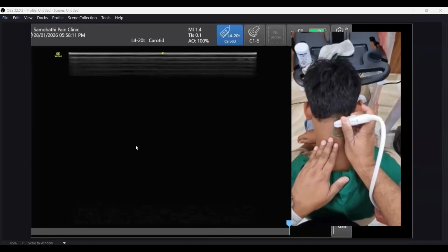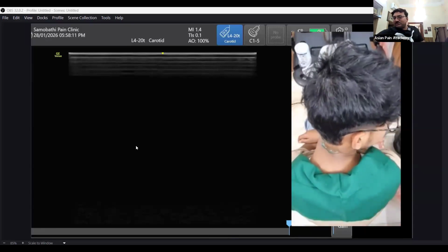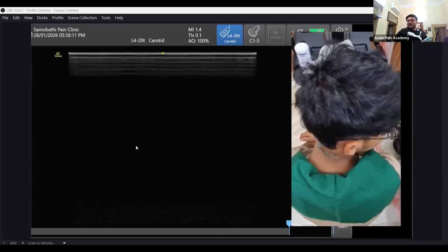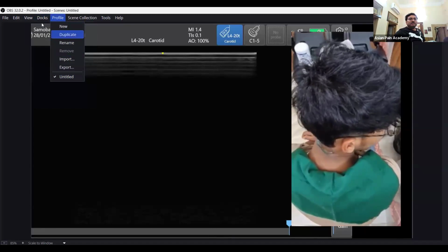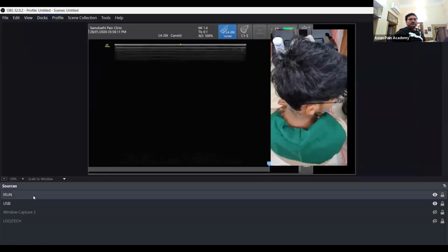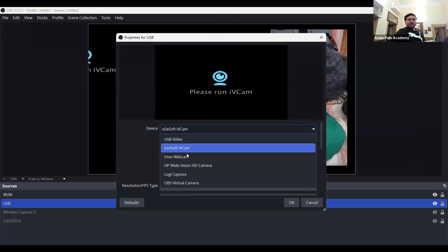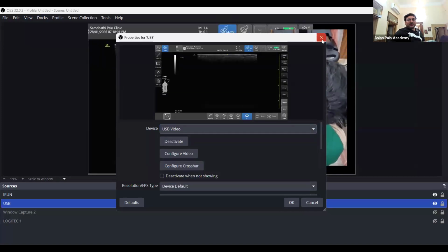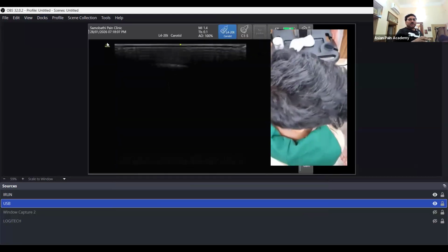Sir, can you see the ultrasound screen image? No, sir, the ultrasound image is not coming. Just one second. Now I think it will come. Now it is coming.